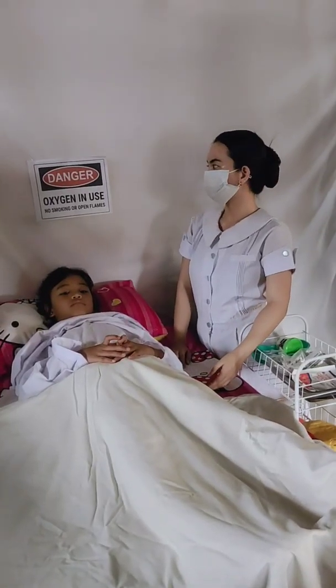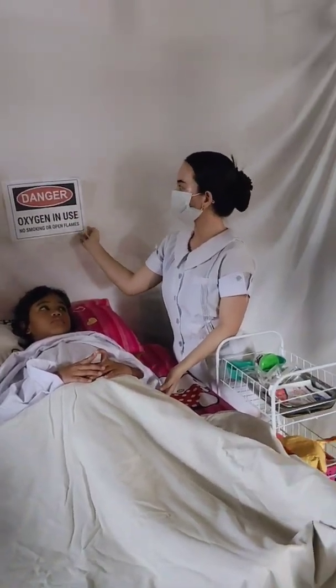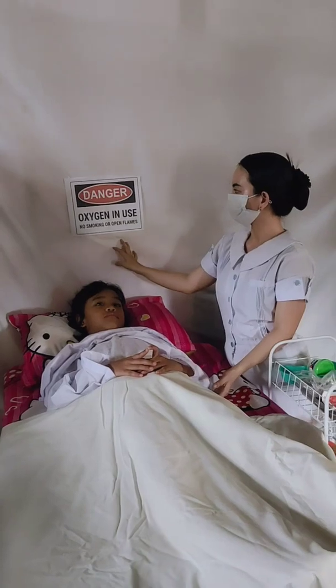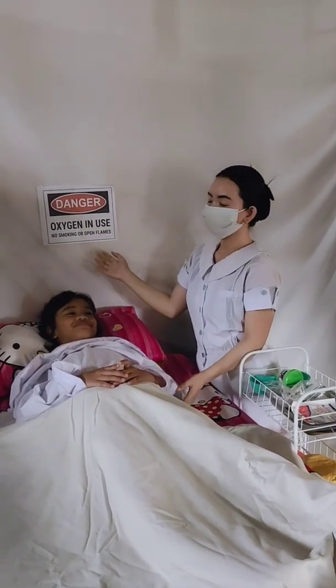And then, place oxygen in use and no smoking signs at the entrance of the patient's room and overhead of the bed. This is to prevent fire because oxygen will make a fire burn hotter and faster.